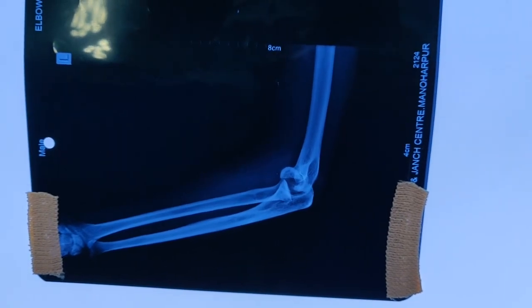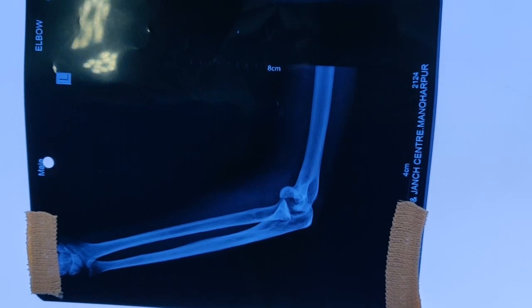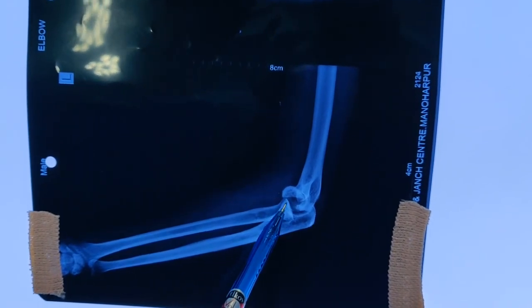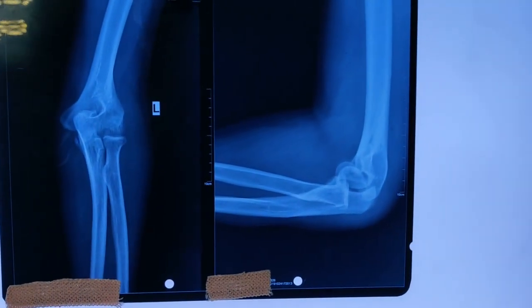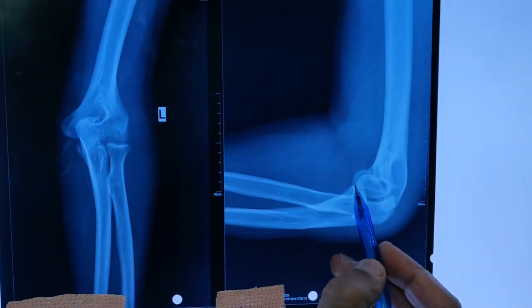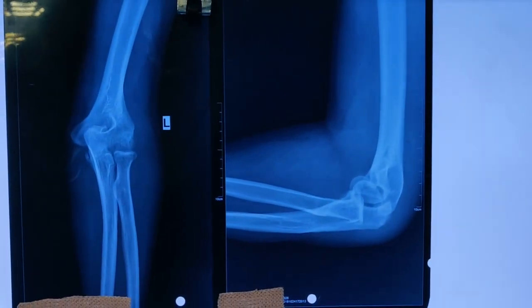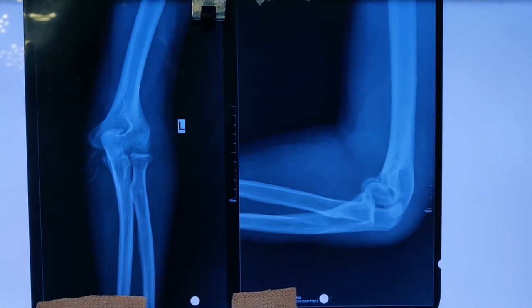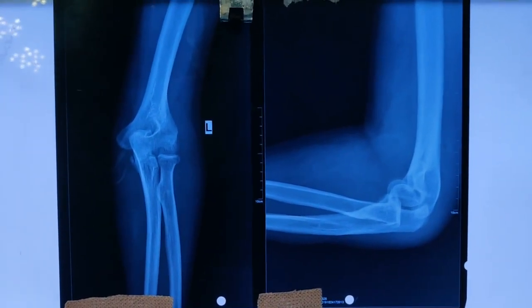There is a classification system by Bryan and Murray which classifies these fractures into type 1 to type 4. This looks like a typical type 1 fracture, however on the oblique or lateral view you see a double density — one density here and one there — which tells us this is not only a fracture of the capitellum but has also involved the trochlea, making it a type 4 injury.